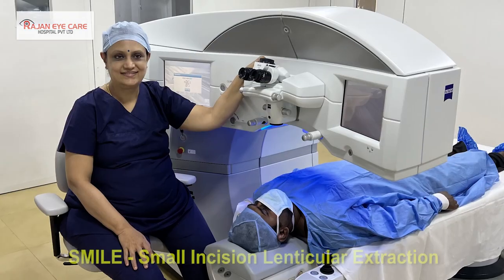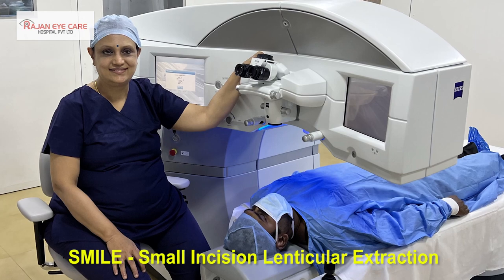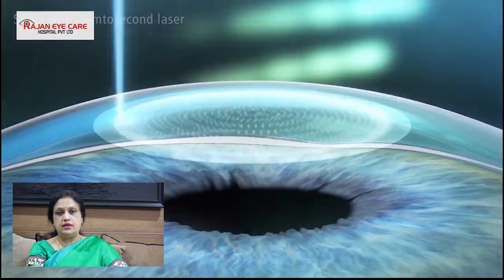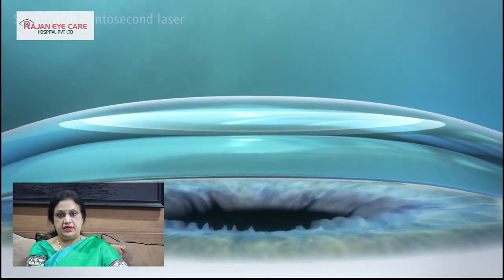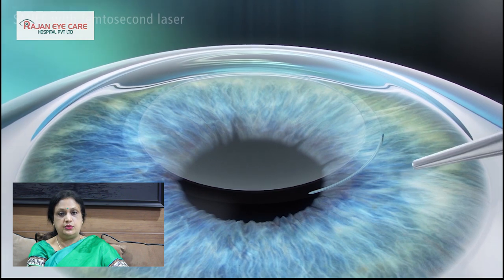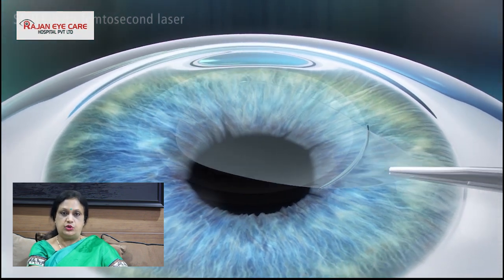After LASIK came SMILE — Small Incision Lenticular Extraction. A femtosecond laser is used to make a small corneal disc intrastromally, and this disc is removed to correct the power. The advantage of SMILE is very fast recovery. The incision is extremely small — around 3 to 4 millimeters — compared to LASIK where the flap opening is around 20 millimeters. So healing time is faster and the patient can get back to normal life very quickly.